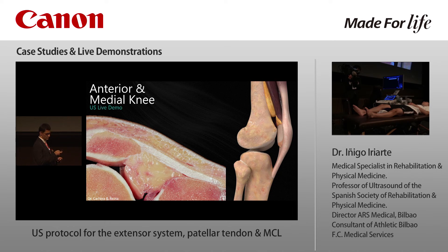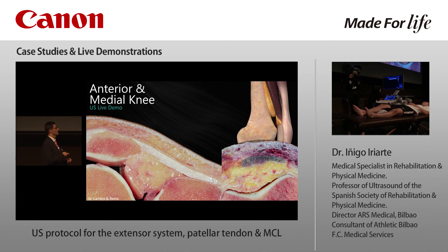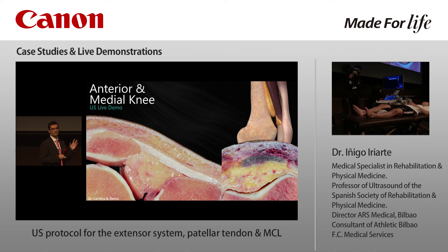If we continue distally, we will see the patellar tendon. The patellar tendon must always be checked in both axes. It's very wide, so we need to perform a full scan of the tendon in order not to miss any injury.